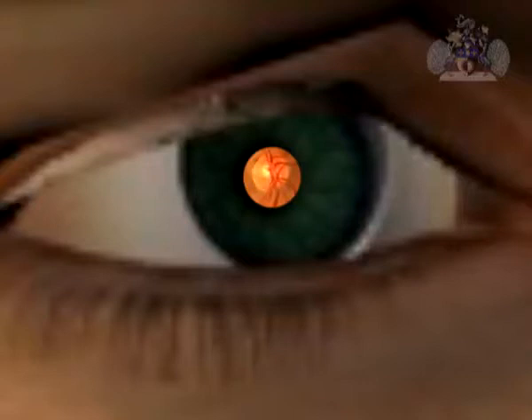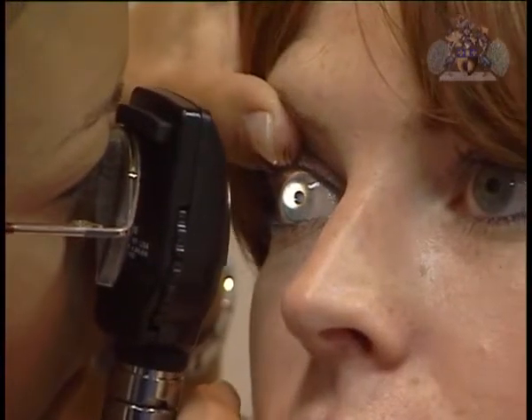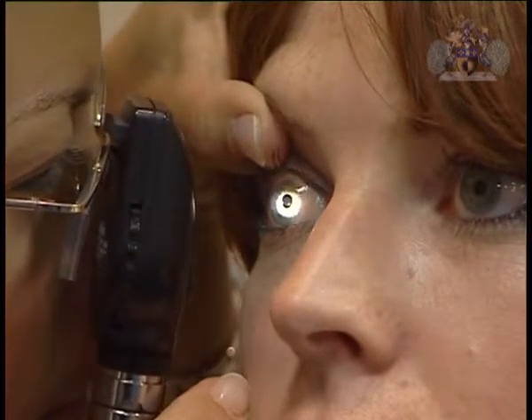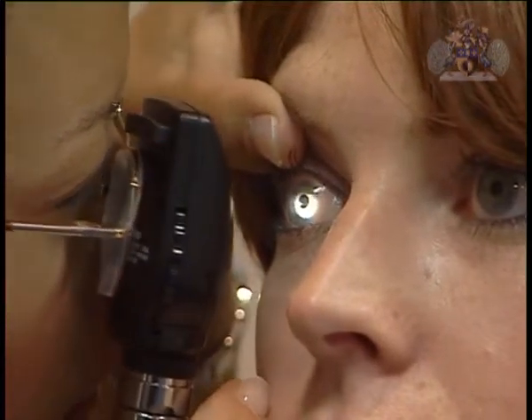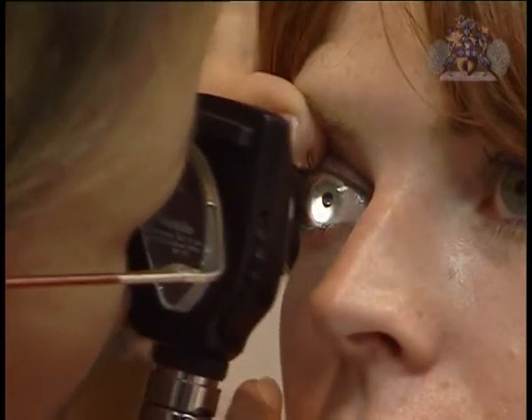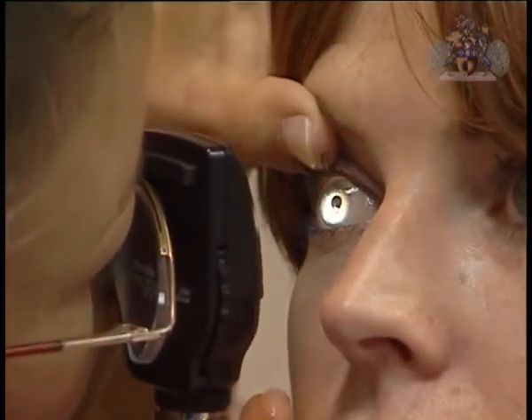Stability is important because instability further adds to the difficulties of focusing the ophthalmoscope. The left thumb is usually resting on the patient's brow, but may be needed to lift the upper lid to allow viewing through more of the pupil. The right hand holding the ophthalmoscope is resting on the patient's cheek.